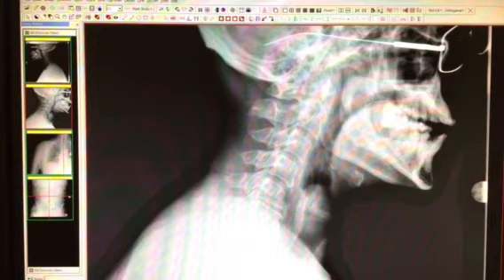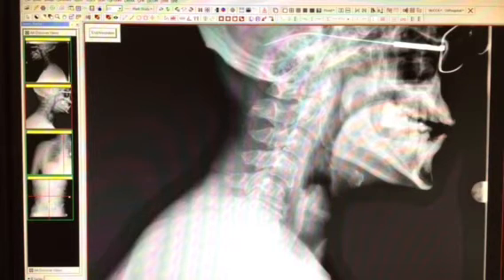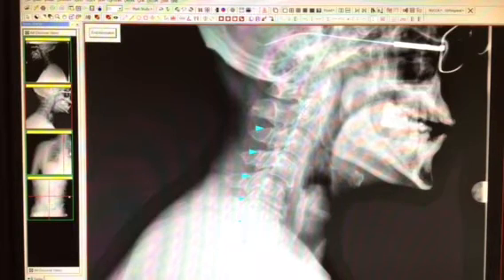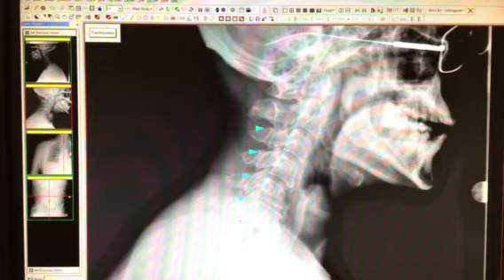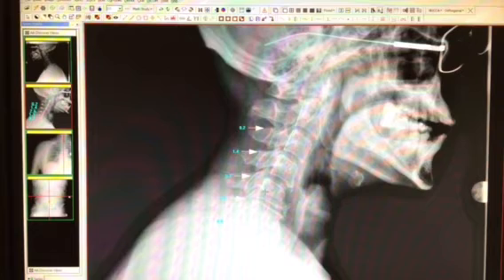We're going to start by mapping the cervical spine, marking the superior posterior aspect of the C2 vertebral body, moving down to the inferior posterior vertebral aspect of C2, and then doing the same at C3, C4, C5, C6, and C7. Be as consistent as you can with placement of those marks on the posterior aspects. On the video, C7 is not as readily apparent as on the screen, so adjust the contrast if needed to get those marks correct. Now we've mapped the cervical spine all the way down to C7.